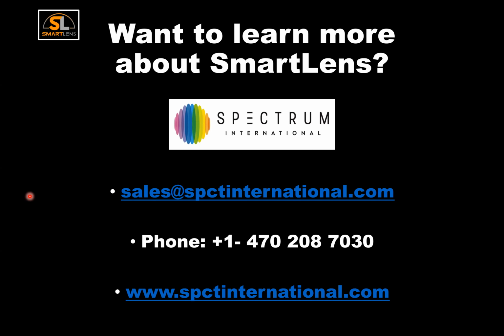Dr. Nesar, a great friend of mine, asks: does peroxide affect the lens material? As long as it's an approved GP lens, we haven't seen peroxide as an issue at all. In fact, solution systems like ClearCare have been a great option for our scleral patients, because they take the lens out of the case and really don't need an incredible amount of rinsing of the lens. Basically that neutralized fluid becomes like saline.